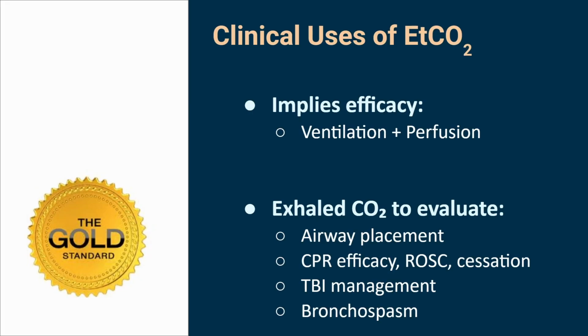Most people are like, oh, his end tidal went from 30 to 10. He's not coming back. I'm like, no. Two things. It's a decent predictor that they will not likely come back, but it isn't a reason to stop specifically. It's a combination of stuff. Like it's a witness arrest. Yeah. That it's not just end tidal.